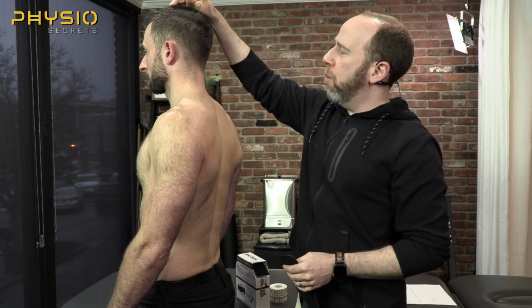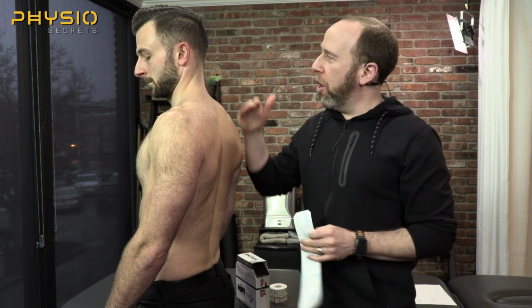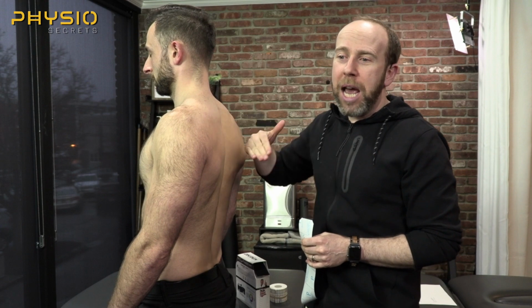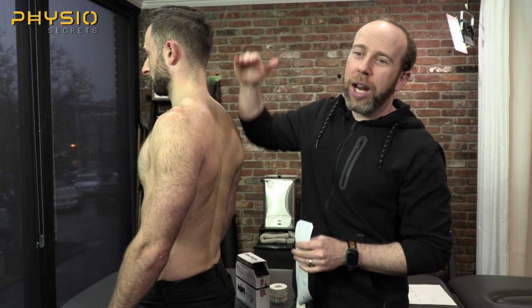Now, you might say, well, the direction of tape matters. It matters whether you tape from the bottom up or the top down. Nope. It doesn't matter at all. So what I don't want to do is end up in his hairline. So I'm going to tape from the top down. By taping from the top down, I ensure that I'm going to finish at the bottom. I'm not going to tape from the bottom up, because then I might accidentally cut a piece that's too long and end up in his hair.